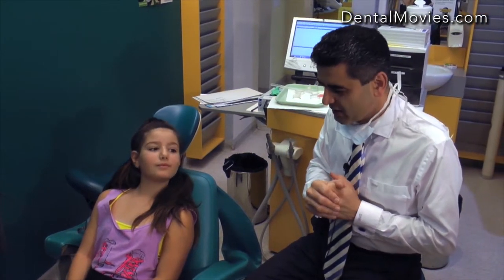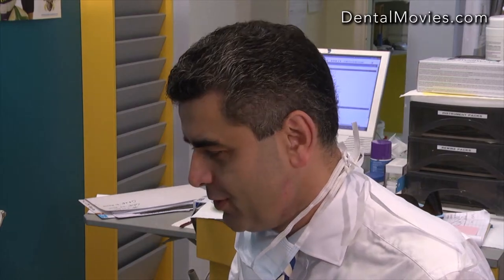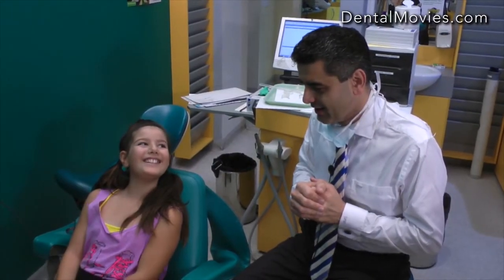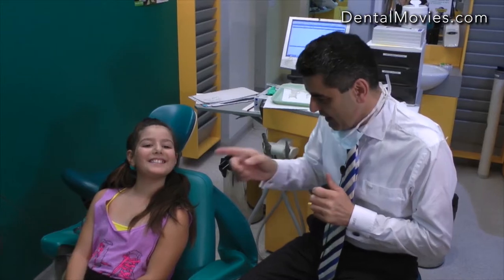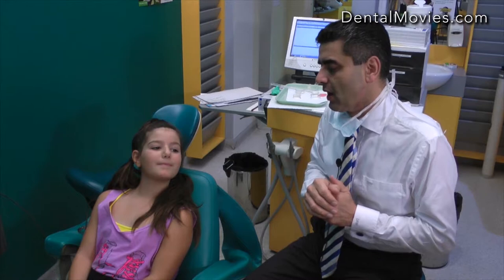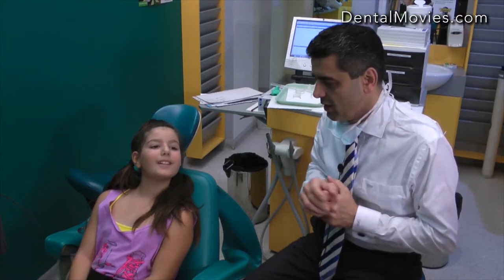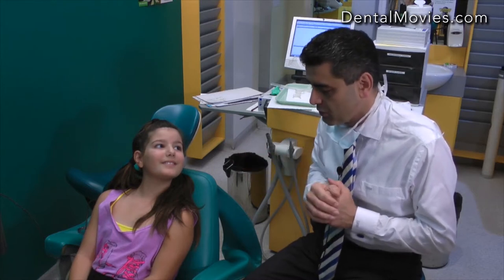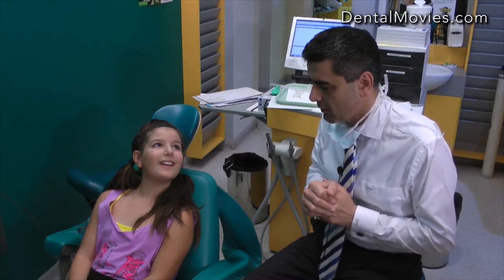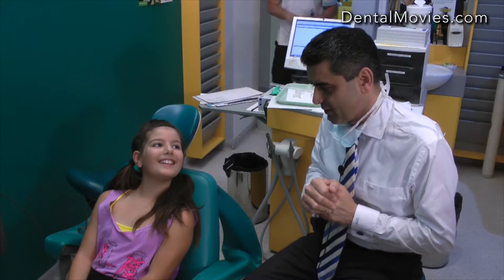Today we have Angelina with us. Angelina is nine. We're going to take some photos of your teeth and some photos of your face so I can put them on the computer. Next time you're here, I can show mum and dad exactly what we're going to do with your teeth. We can make them more white after we straighten them, but at this stage we need to make a little bit more room for your teeth.